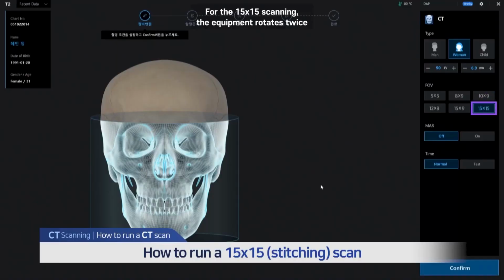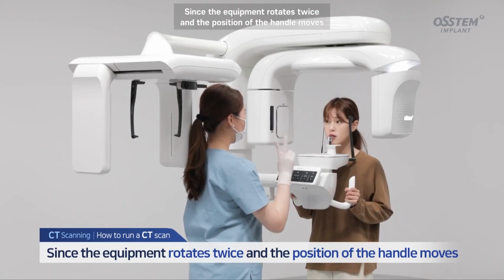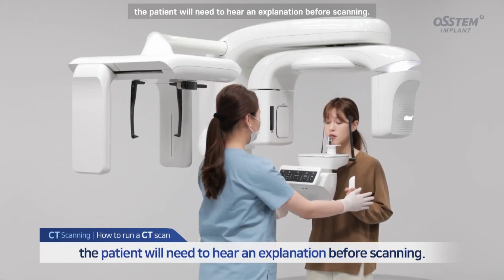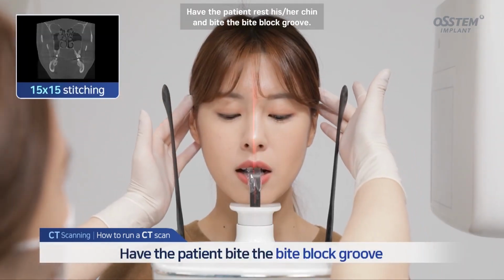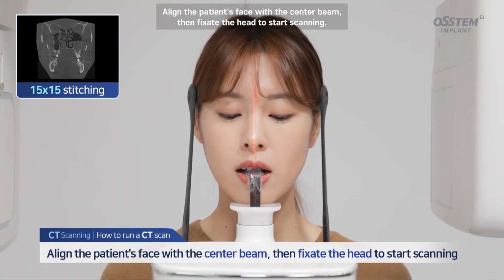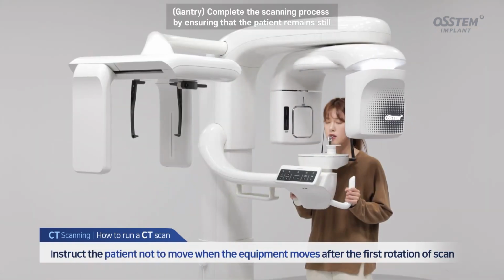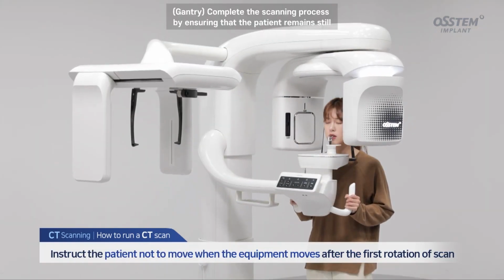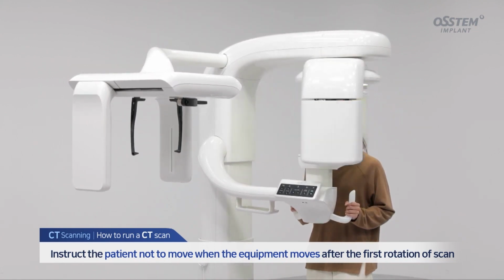For the 15x15 scanning, the equipment rotates twice. Since the equipment rotates twice and the position of the handle moves, the patient will need to hear an explanation before scanning. Have the patient rest his/her chin, and bite the bite block groove. Align the patient's face with the center beam, then fixate the head to start scanning. Complete the scanning process by ensuring that the patient remains still when the equipment moves after the first rotation of scan.